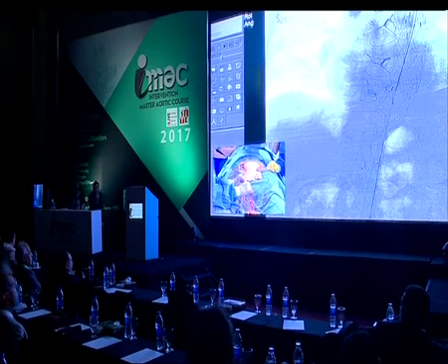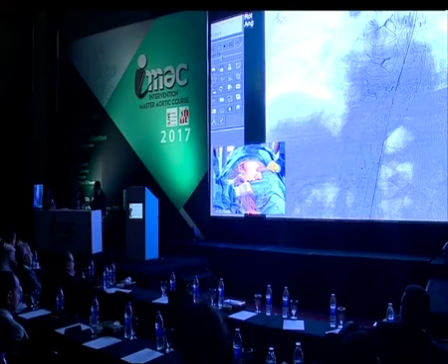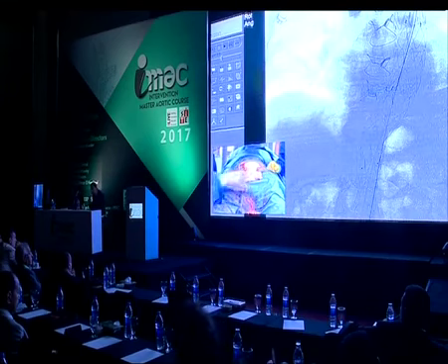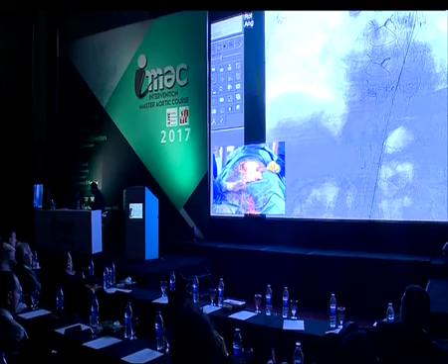I would think that you should run anything between 10 and 20 centimeters of H2O. We can wait for 10 minutes and measure again, or immediately try to drain CSF?